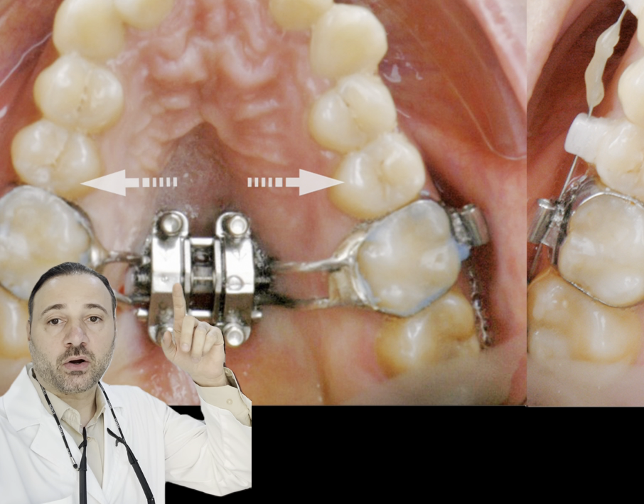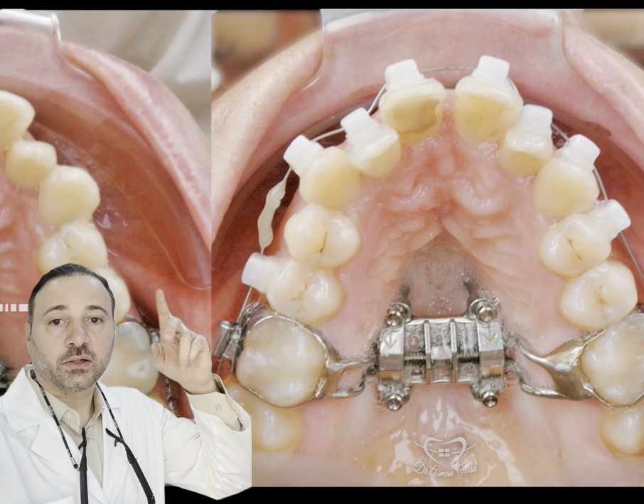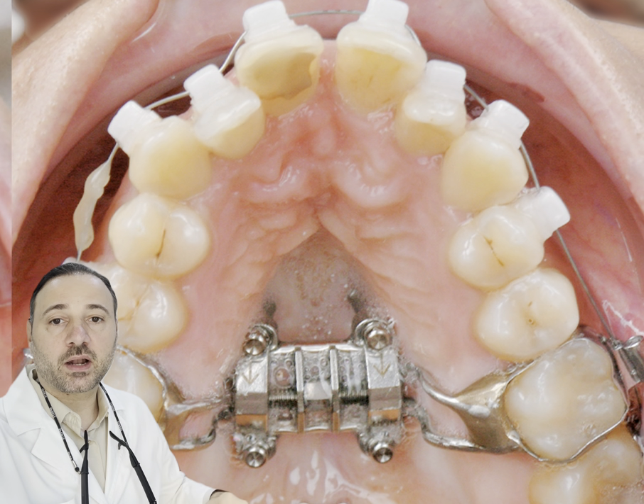We are using those four palatal TADs to insert the MSE expander and provide skeletal expansion for adults.